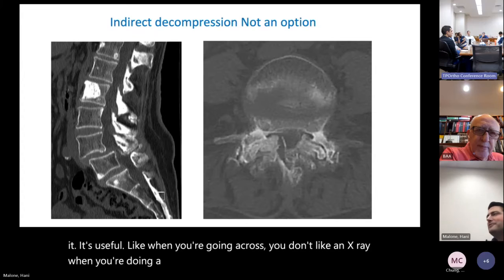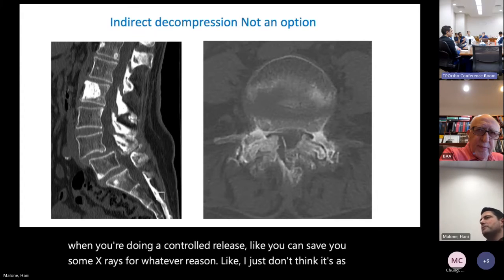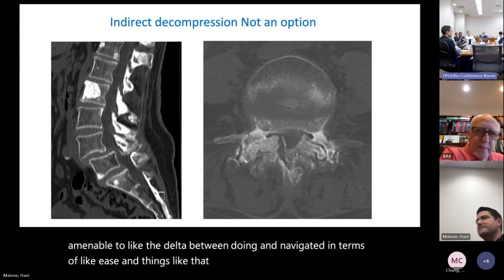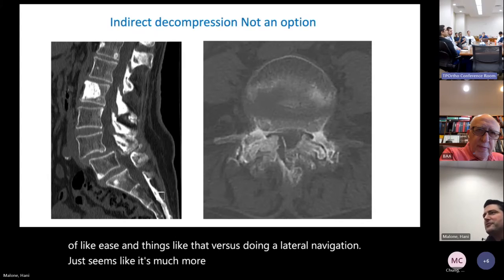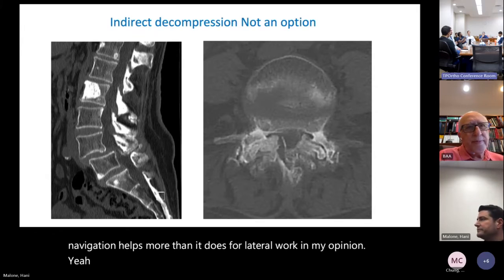contralateral release. It can save you some x-rays, but for whatever reason, I just don't think it's as amenable, in terms of ease and things like that, to doing a lateral navigated versus doing a TLIF navigated. It just seems like navigation helps more for TLIF than it does for lateral work, in my opinion. Yeah, I would agree with that. Yeah, I would too.